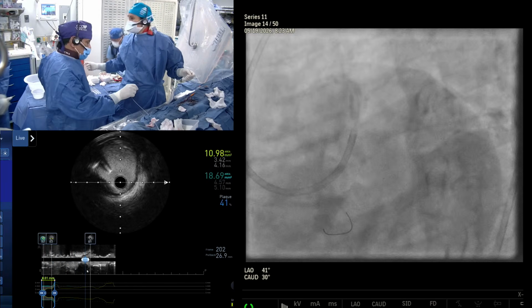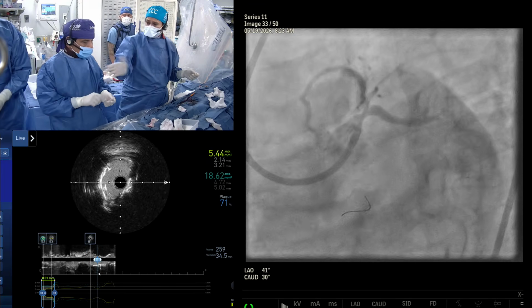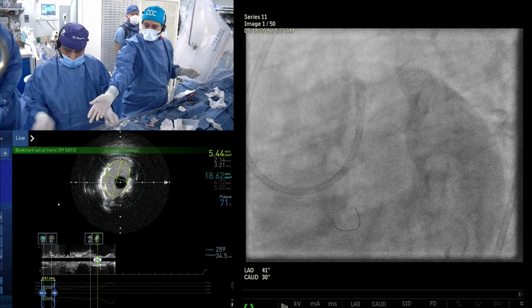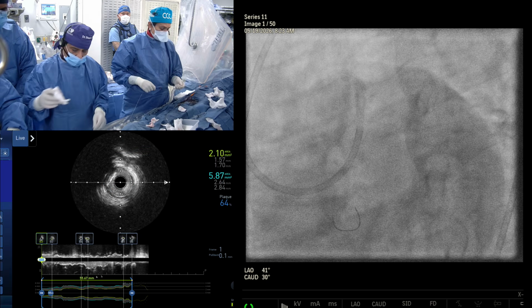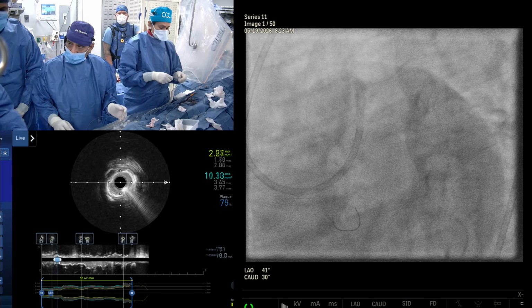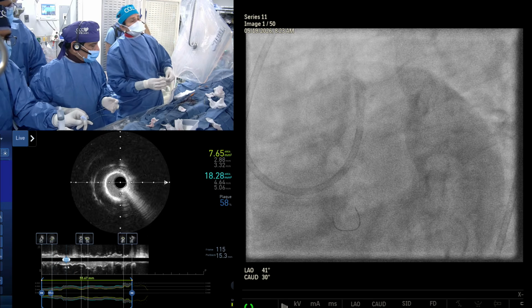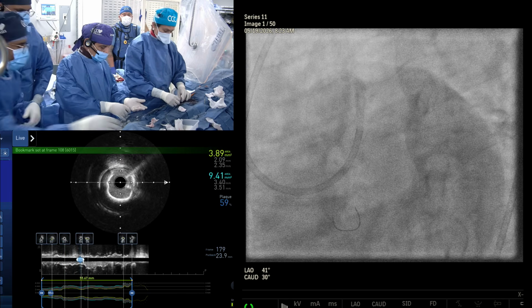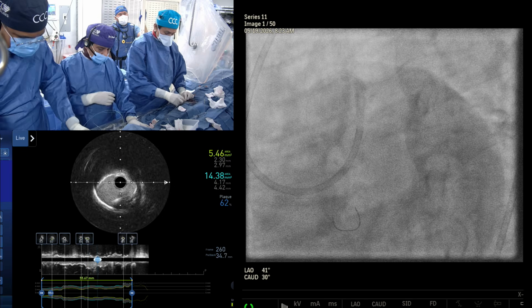What is it? No, there's 20. Yeah, good. No, hold on. Let me finish the circ. You just said finish the circ. You're going to address the distal lesion first, no? Yes, circ, yes. What stent are we doing? This was the Synergy case, right? Synergy on the right side. That's okay, we can do anything. Whatever you want. 3.0, 3.5? Circ looks 3.5. 3.5, 16. Yeah, 3.5, 16.